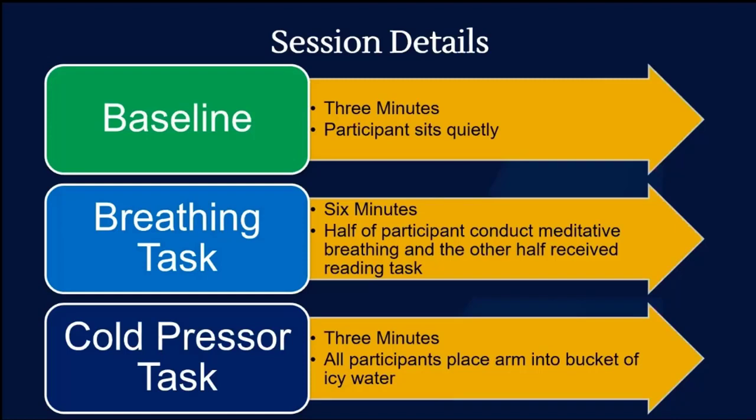So the idea here is that we can see if this breathing task has the effect and is able to provide protective features for that person once they're undergoing the stress induction. So that's the cold pressor. If the breathing, the meditation, actually works, do we see a reduction in the actual stress response once they place their arm into the bucket of icy water?